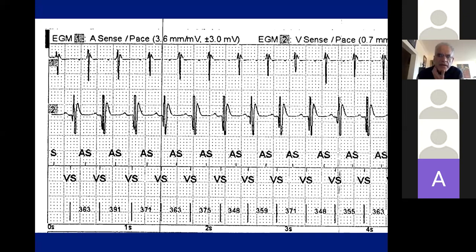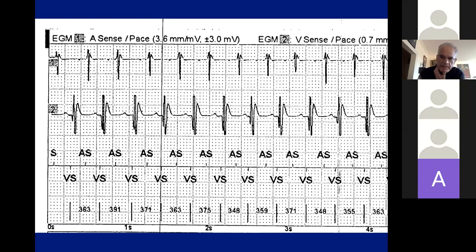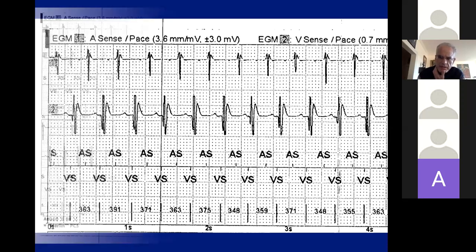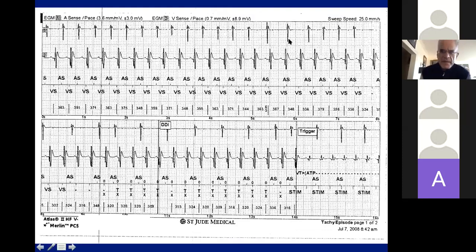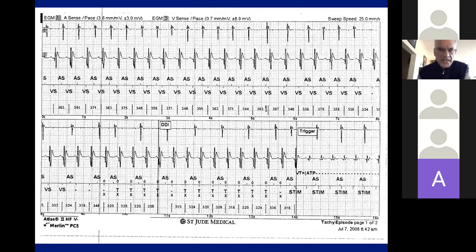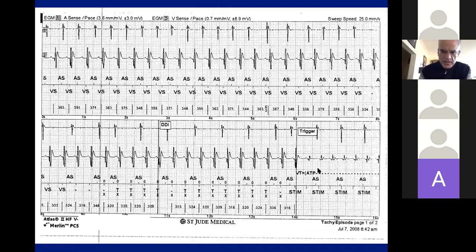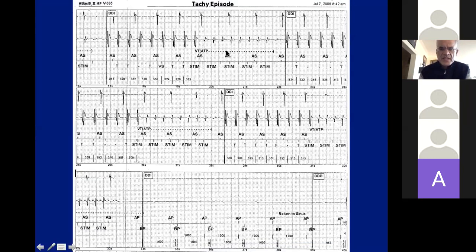The ventricle is driving the atrium. Here, a longer V-to-V is followed by a longer A-to-A — that's another example. Longer V-to-V, so you suspect this is VT. On the continuation of the same episode, there is very clearly VA dissociation at the bottom, confirming it was VT. So one-to-one AV relationship does not necessarily mean SVT — always look at who is driving whom. The episode took several rounds of ATP: ATP number one, ATP number two, and finally it breaks.